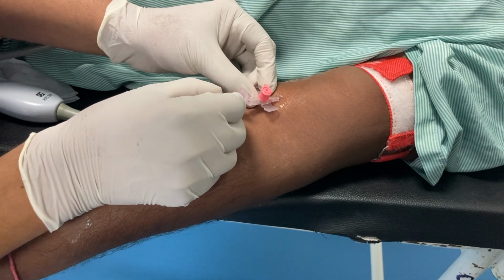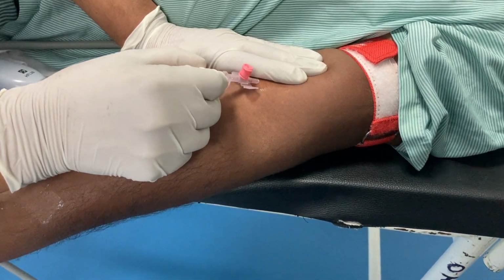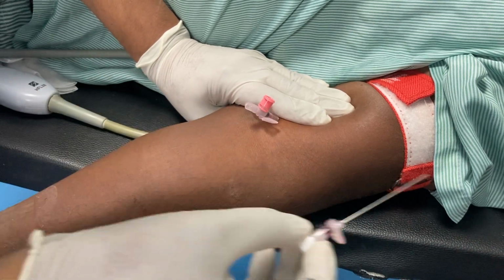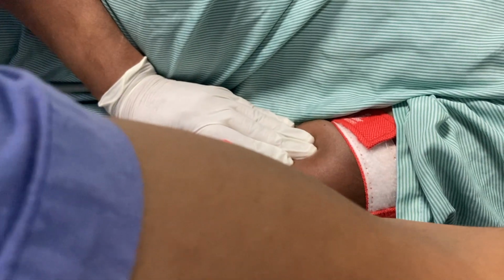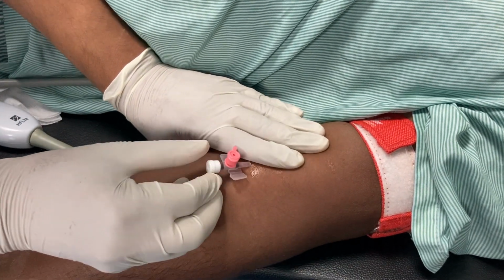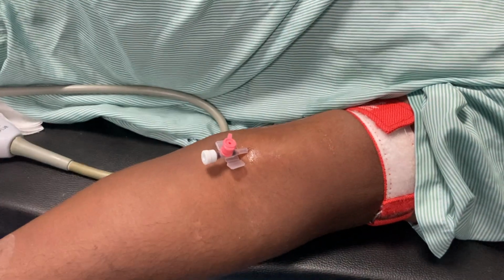Now I have to advance my cannula. Okay. Now we will attach drip.